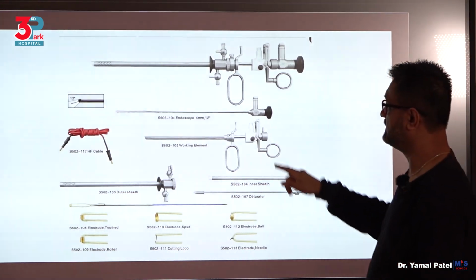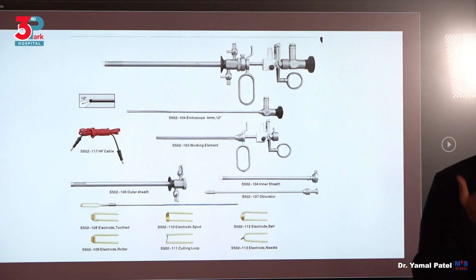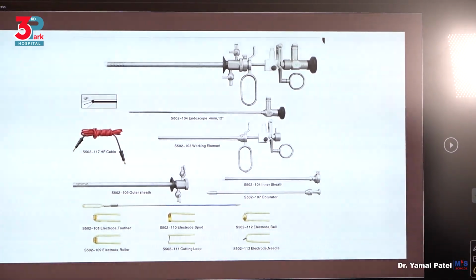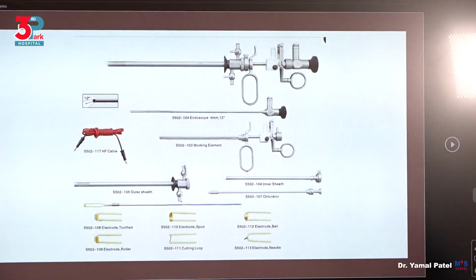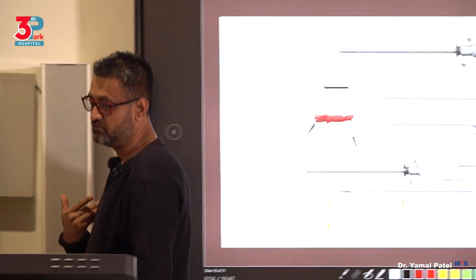I told you the telescope, see, it's already written 12 degrees. So it's almost understood that when you are talking of hysteroscopy, you should know that the scope I'm going to use is a 12-degree scope.